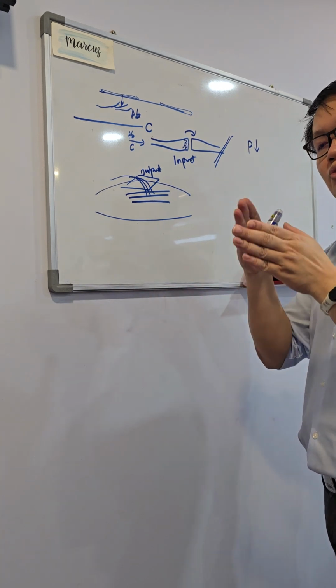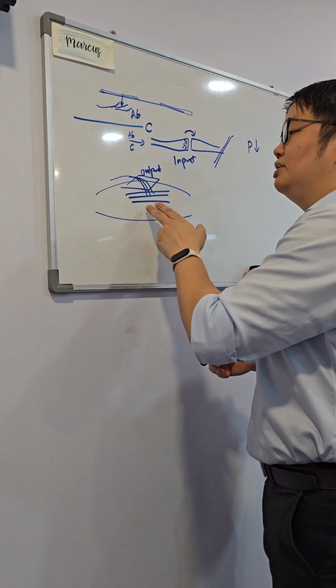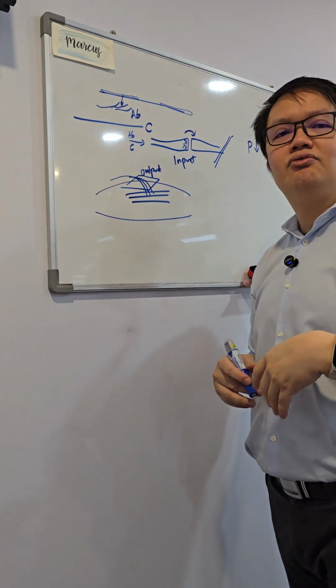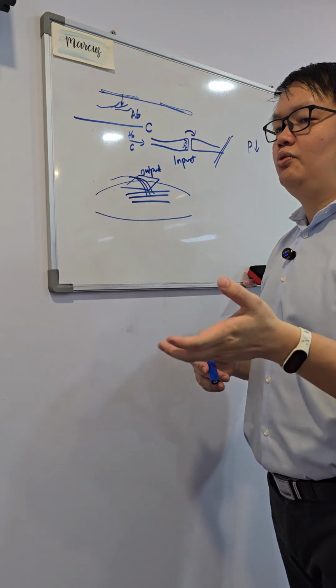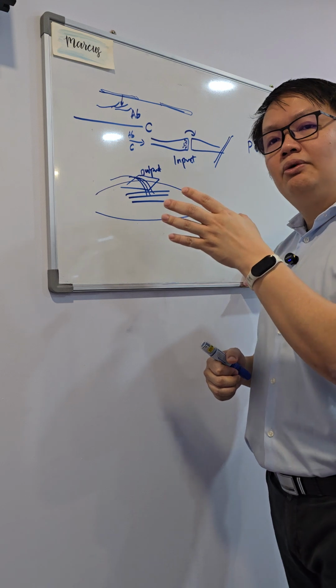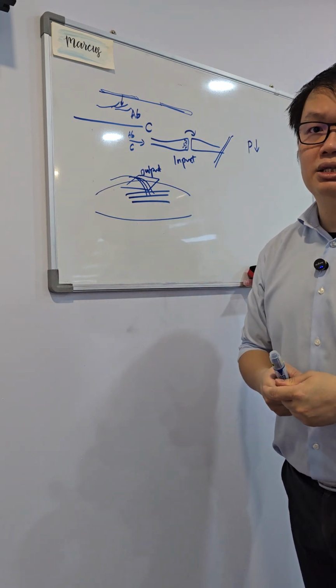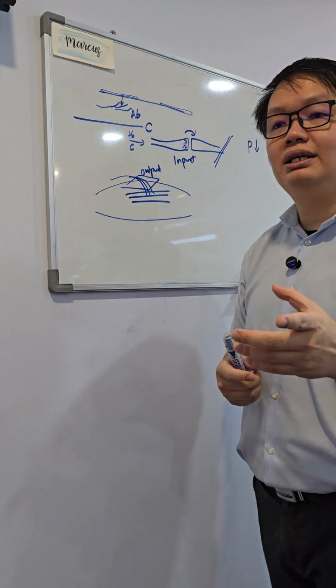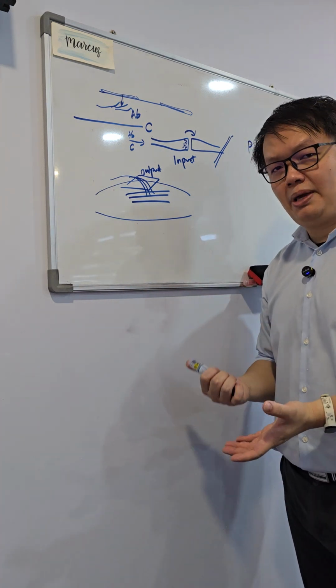And because we're doing it in a rhythmic manner, it allows the brain to say, hey, I can relax this area more. So one, we're stimulating it to allow a reset of this neuromuscular guarding that we have, and the neuromuscular guarding can contribute to a presentation of a person's pain.